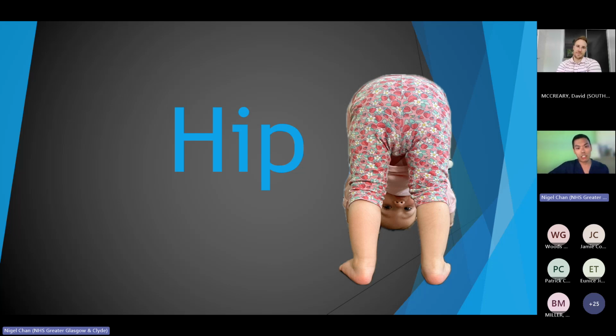But the idea of using point of care ultrasound is to help narrow down your list of things, and hopefully you can avoid doing bloods. And otherwise, someone who looks completely well and you're convinced they've got a transient synovitis, it just helps you visualize it. And I've also found that it helps explain to the parents at the bedside what transient synovitis is, if they can actually see the effusion in the hip, rather than me trying to explain it and giving them an information leaflet.